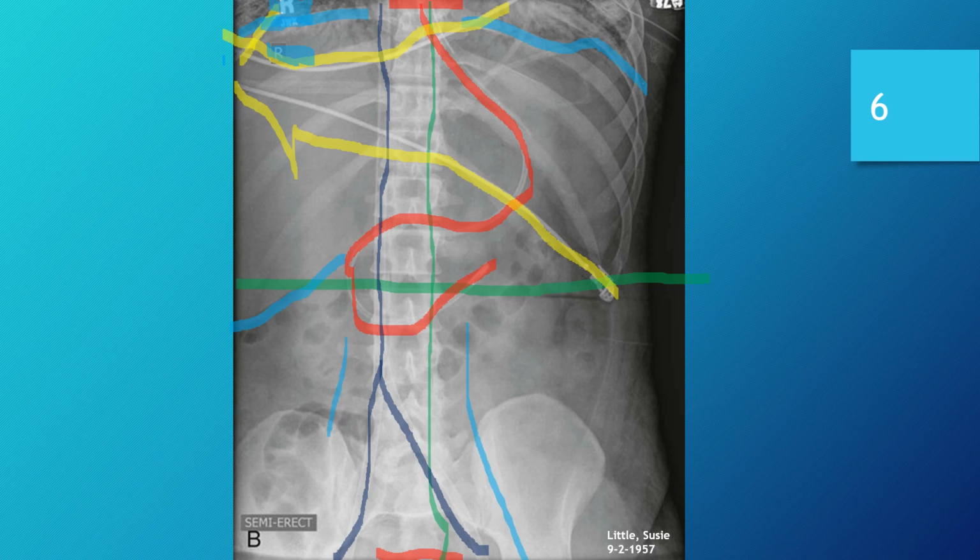So great that there's an anatomical marker that goes into our reference information, but bad placement, as well as placement for the digital indicator that they put in. The real marker is here, and I believe this one was added digitally afterwards, and they put both of them in a region that would be of pertinent interest. So definitely need to avoid that.